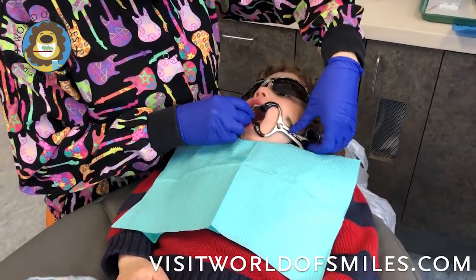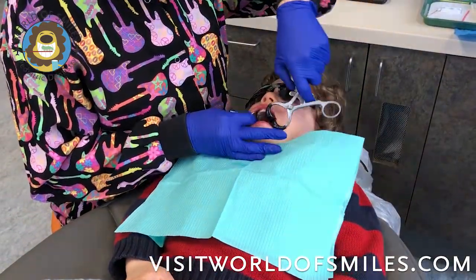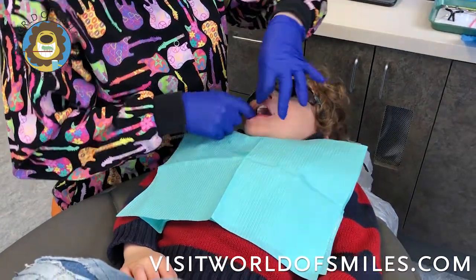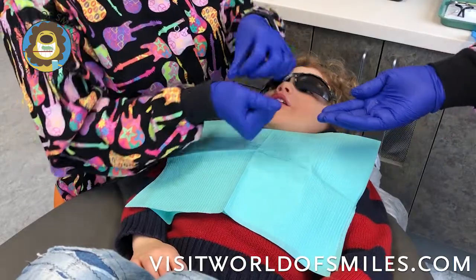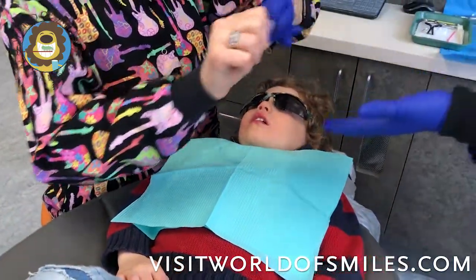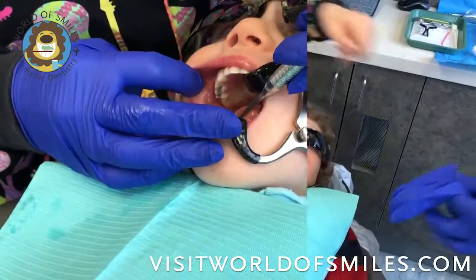After one minute has gone by, we're going to apply some topical fluoride varnish, and then we can be done for the day. It's important to take everything out of the patient's mouth and wrap it up immediately in your gloves so that the silver diamine fluoride does not get anywhere.